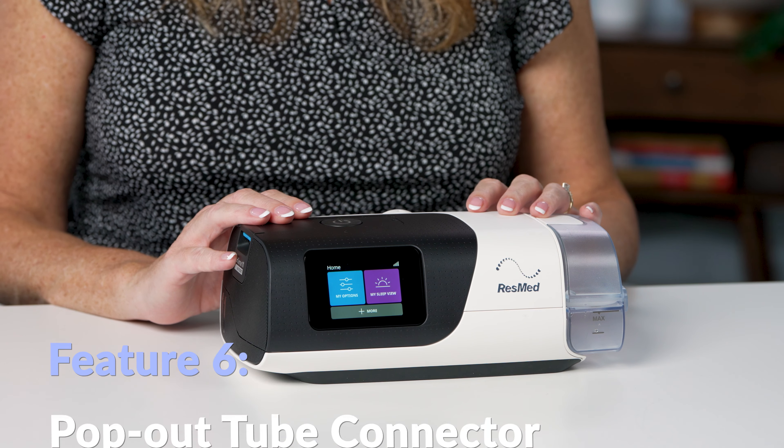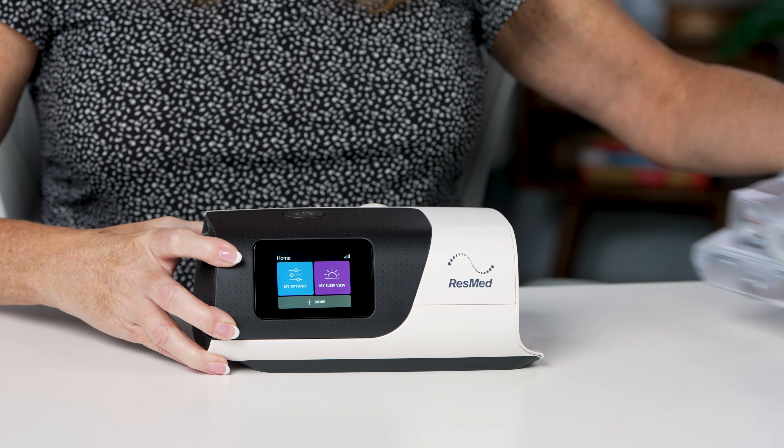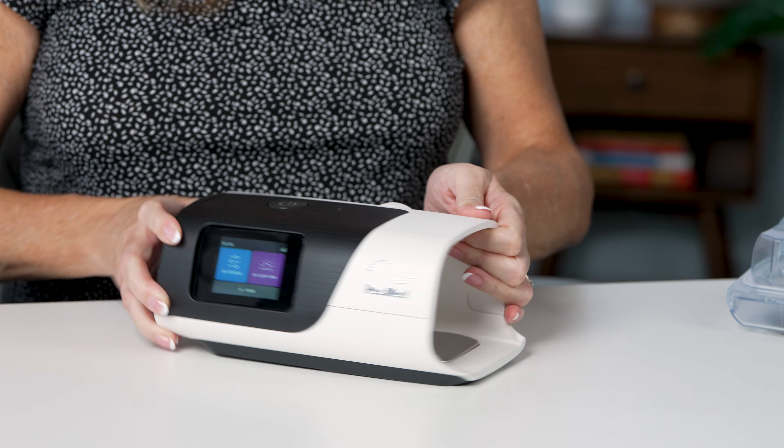To do so, you're simply going to remove the water chamber and replace it with the side cover. This side cover is just going to slide into the side, and now you have replaced your water chamber.